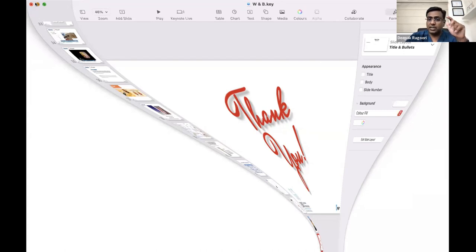Especially for us, unfortunate to say that we all do reuse our so-called single-use accessories here. And they do not retain the same quality after you use them a couple of times. So better be very careful and check them before you use them again. Sure, sir.